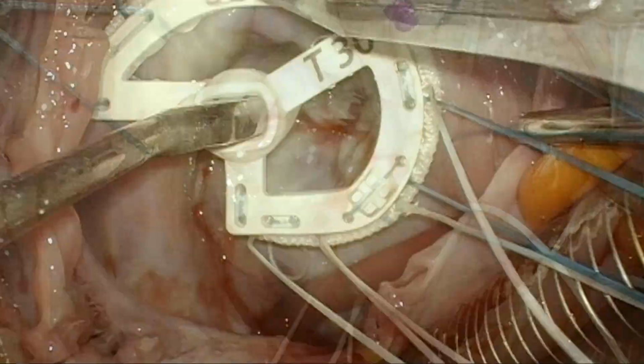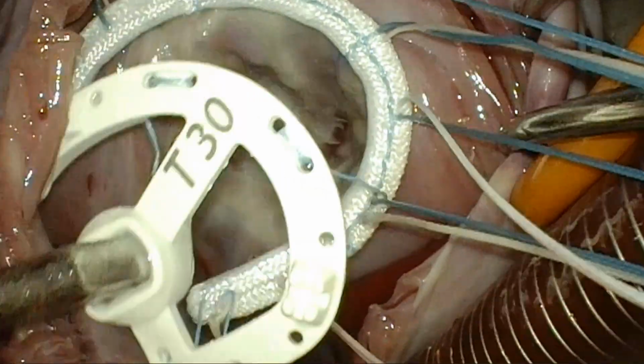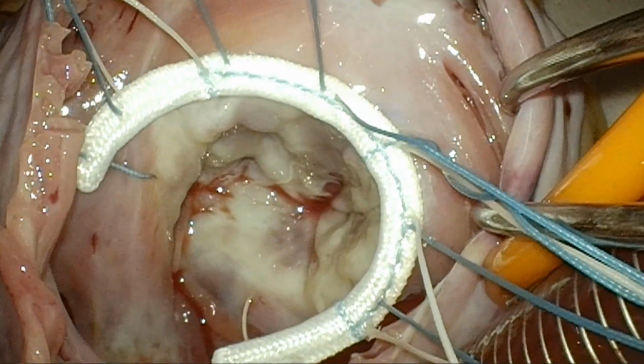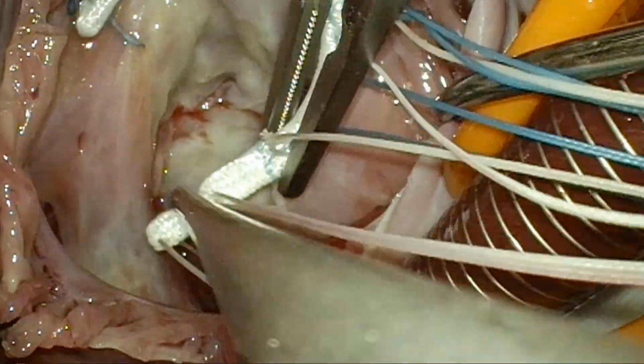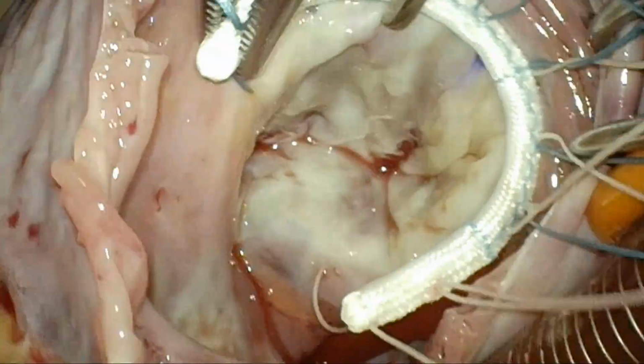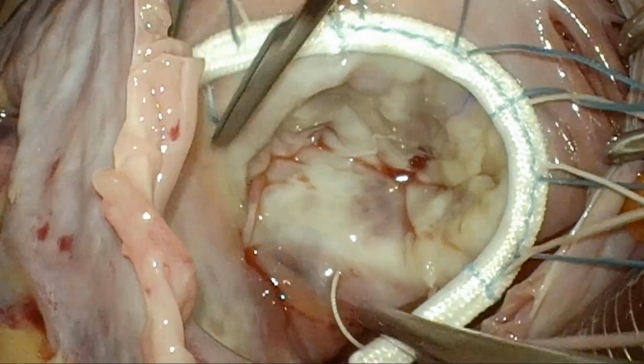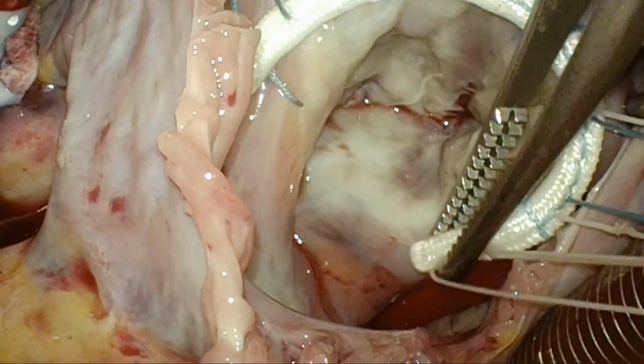So this marking is just to show you that the rigid component of the ring is really limited to the free wall of the right ventricle. And this is very important, because we don't want to use a complete rigid ring. Otherwise, that risk will go up. This is a flexible end, so this ring has a 3-dimensional motion as the heart moves.